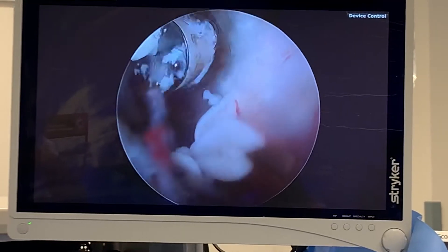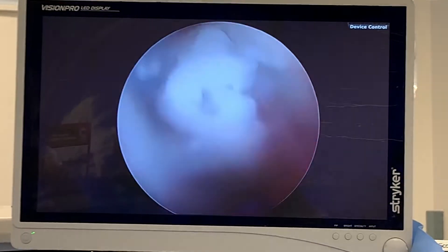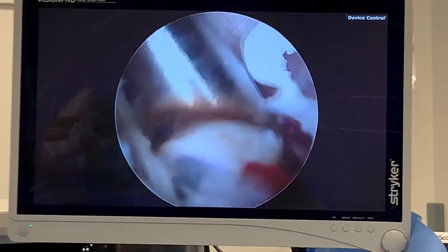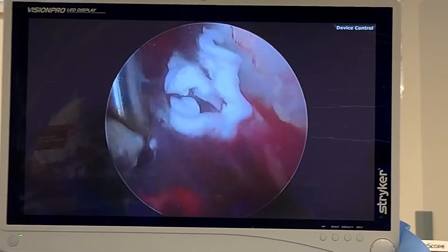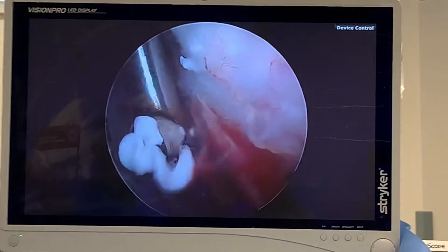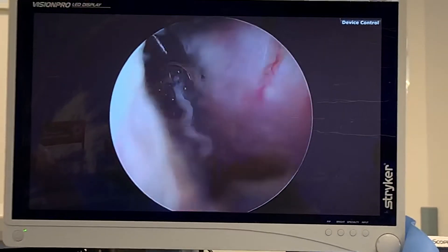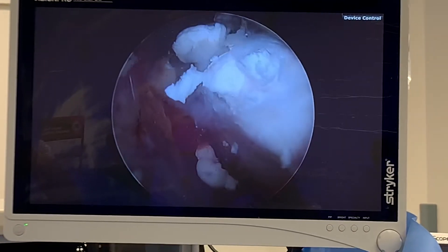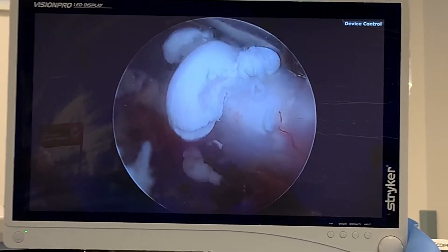Now if you do this in the office, you can certainly hit it with a needle in the office if you have an ultrasound. But the problem is, what are you going to do with all this calcium that goes floating around the joint? See, that will irritate the heck out of the joint. Now, I'm not doing this surgery to decompress the calcium — I'm doing the surgery to fix this rotator cuff tear. This is something that was in the shoulder and I'm not going to leave it here because it irritates the joint.